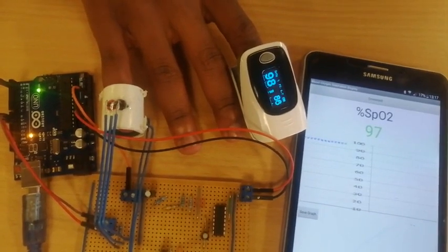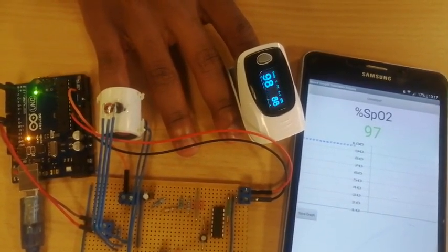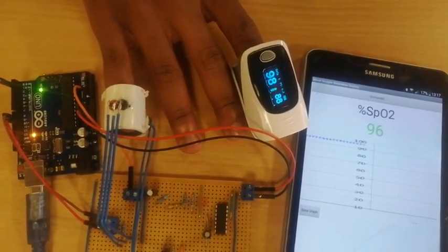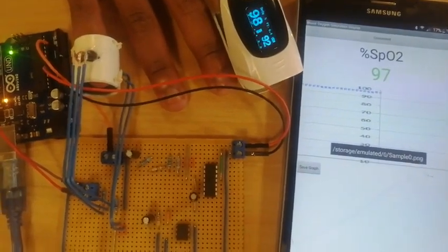And then the application also contains a functionality to save the recorded data on the graph for later analysis. Through the save button, the graph is saved. As demonstrated, the built system is 98% accurate compared to the commercial pulse oximeter.